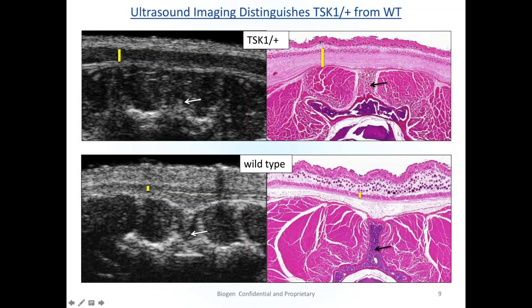And interestingly, all these different features on the histology, so the epidermis, dermis, and then this adventitial layer below, all appear almost homogeneous on the ultrasound image. But we felt that this prominent feature that we recognized with ultrasound represented these bands of connective tissue layers that we could identify with the histology.